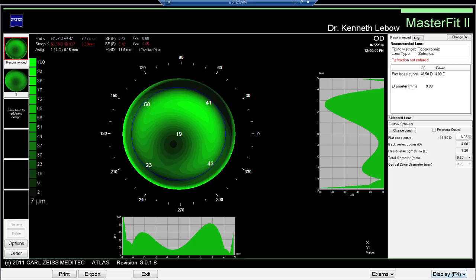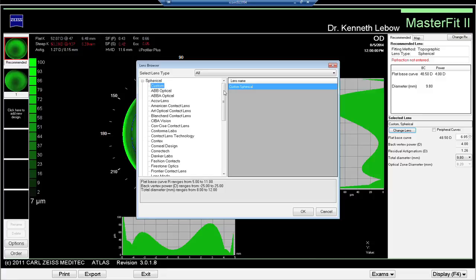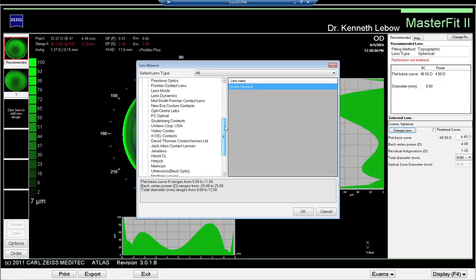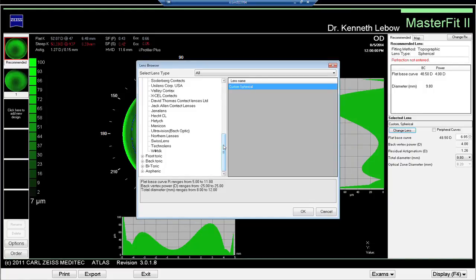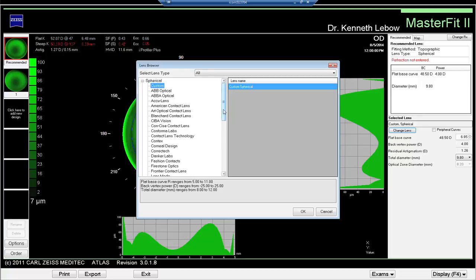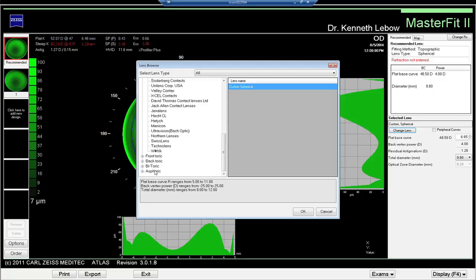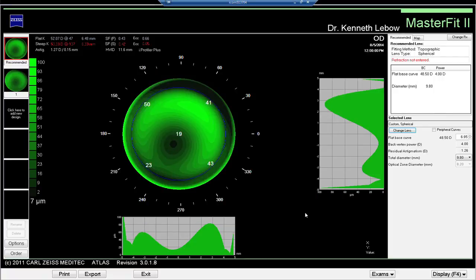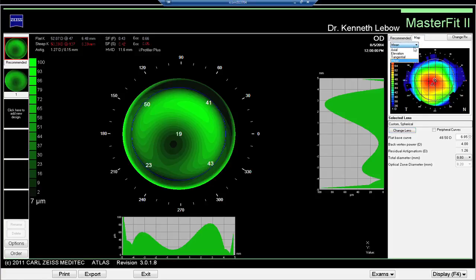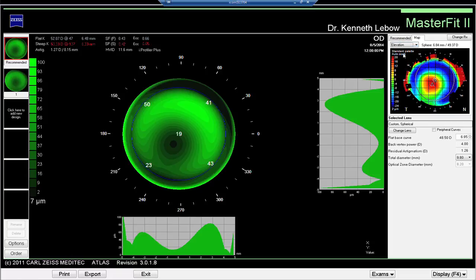Built into MasterFit is a whole host of different algorithms designed to utilize unique fitting opportunities — either spherical, different manufacturers' spherical designs, or front toric, back toric, bi-toric, or aspheric contact lenses. Their unique algorithms are put into the computer so you don't have to call the laboratory to find out what needs to be done. You want to look at what the elevation map is in comparison to the fit of the lens, because that's really the key tool in evaluating rigid gas permeable contact lens fits.